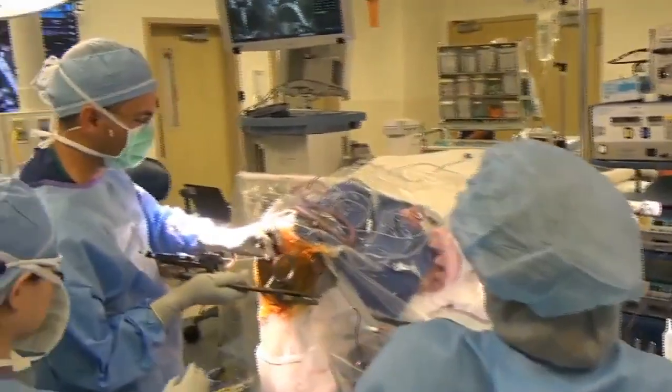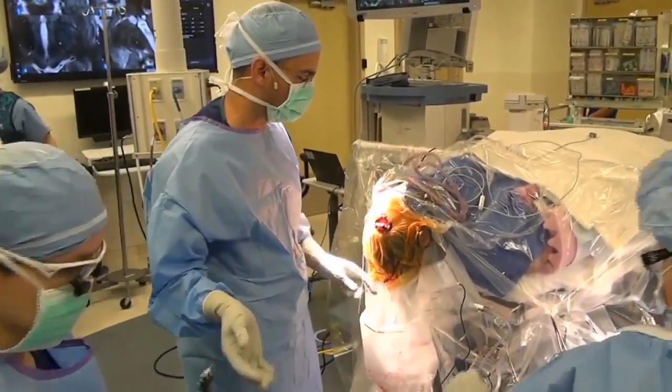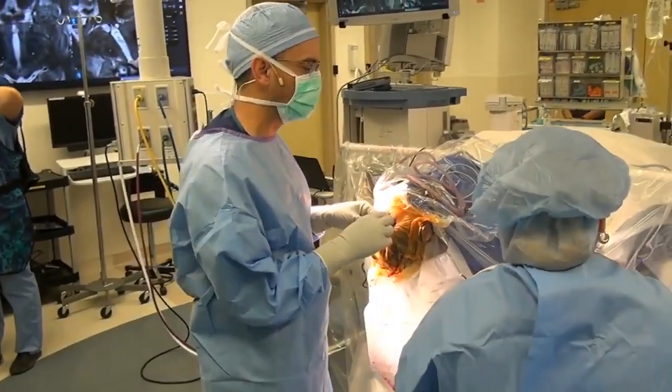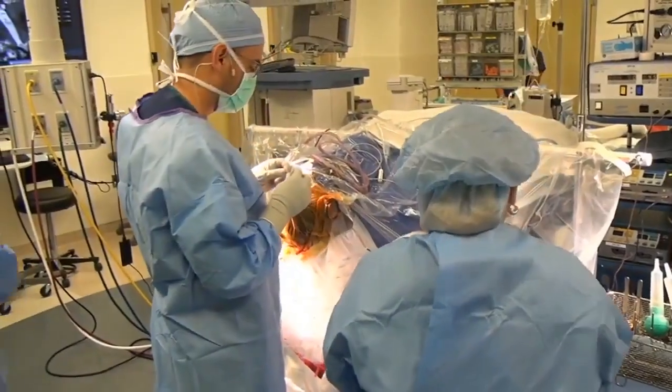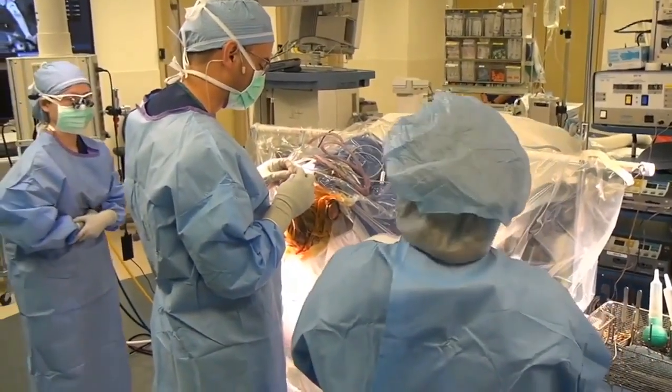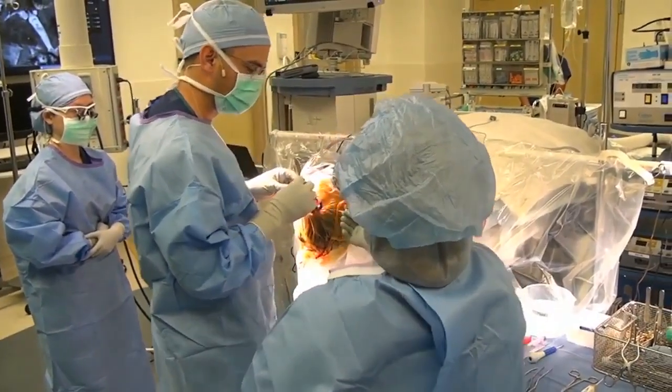Our threshold is usually about 2 millimeters, but if anatomically, relative to the surrounding structures, it still looks a little bit too close to something or too far away from something else, we will reposition. And repositioning occurs maybe 1 time out of 20 to 1 time out of 30 of these wires that we put in.